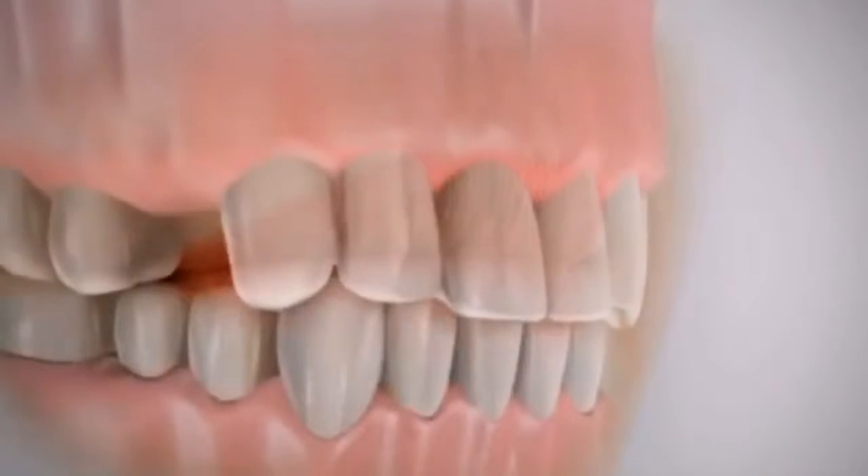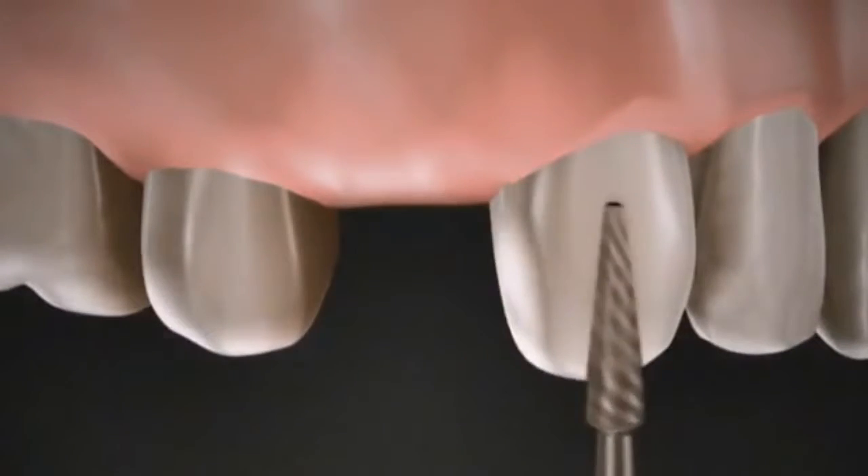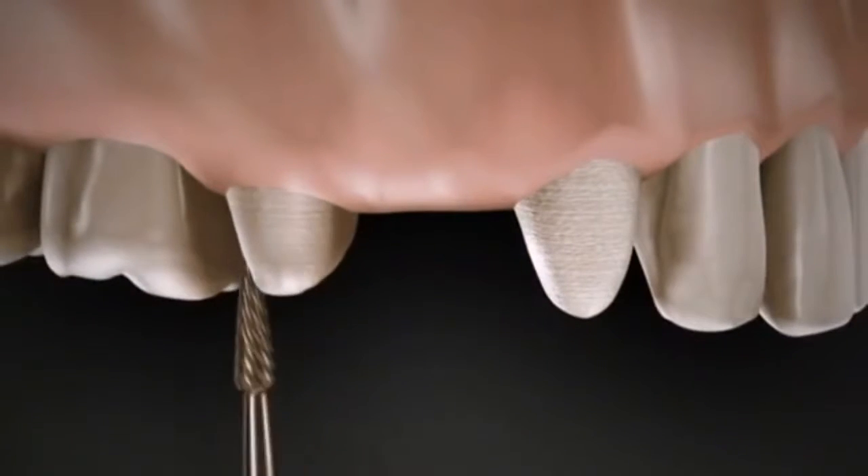Are you missing a single tooth? In the past, the dentist had to grind two adjacent teeth, however perfect and healthy, to support a partial denture.